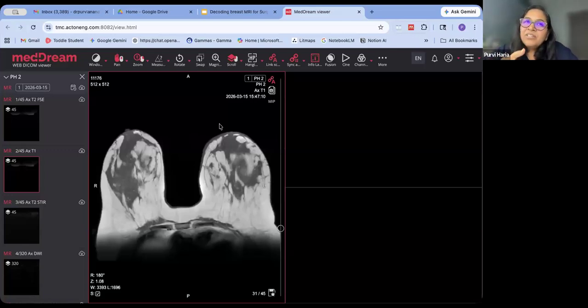So the limitation here comes with the total weight of the patient. Every machine has a different cutoff value. If the entire weight of the patient is more than that cutoff value, then your machine will not take up that patient for scanning, or the patient will not be able to enter the gantry. But other than that, I don't think so.